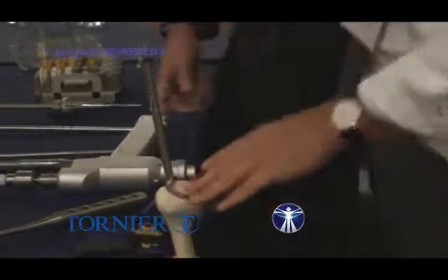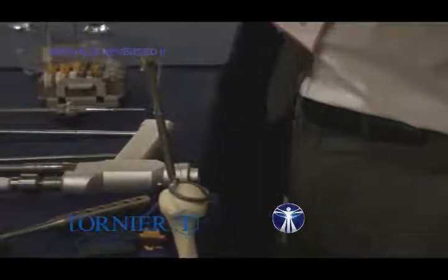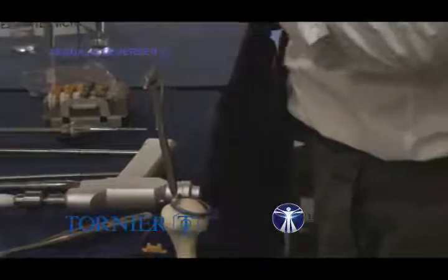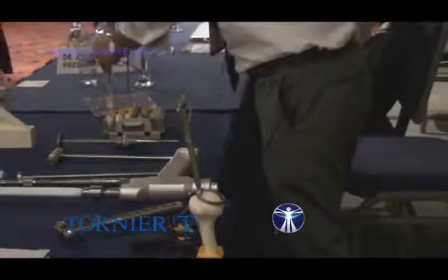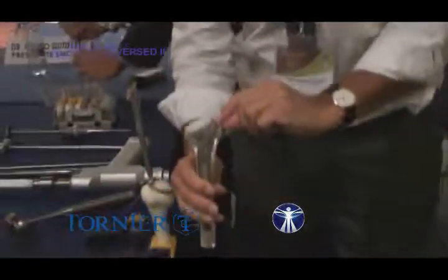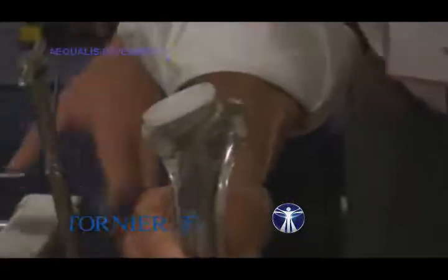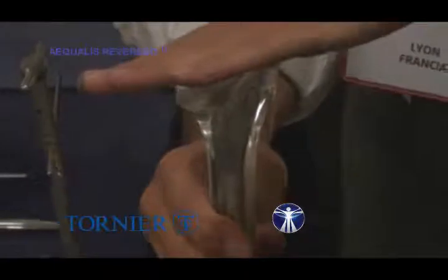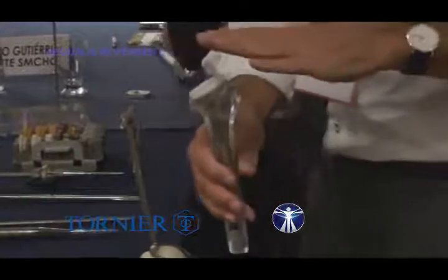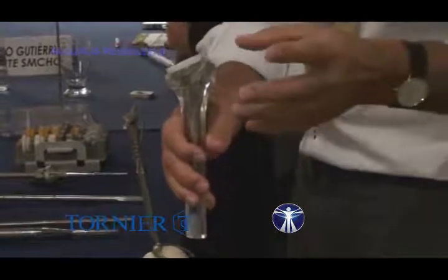That is good for inclination and retroversion. Now, one more: the height. How much should we cut regarding the tuberosity? Don't cut too much. The key point is to implant the prosthesis so that the metallic part is just above the tuberosity. Don't cut too much bone — otherwise you will shorten the humerus. If you shorten the humerus, you shorten the deltoid. If you shorten the deltoid, you get instability.